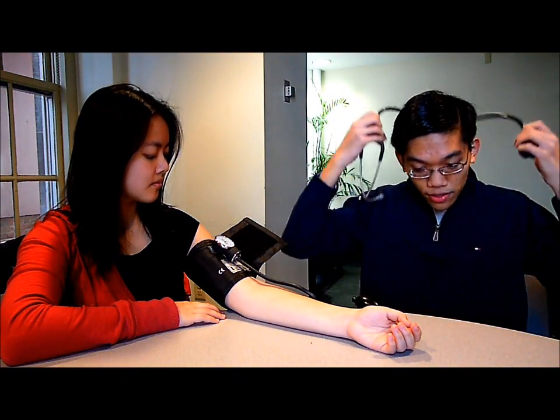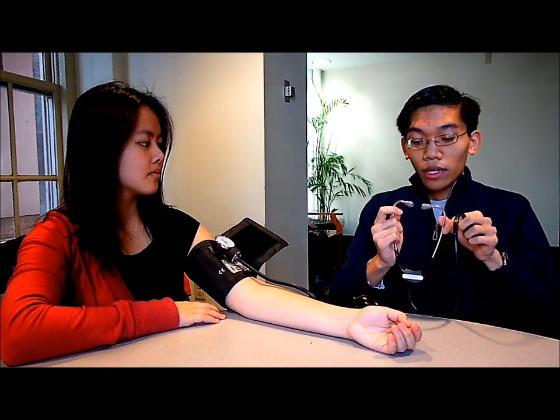Now, you want to take your stethoscope, and again, ensure that the earpieces are angled away from you. As such, take the earpieces and place them in your ear canal to create a tight fit between your ear and the earpieces.